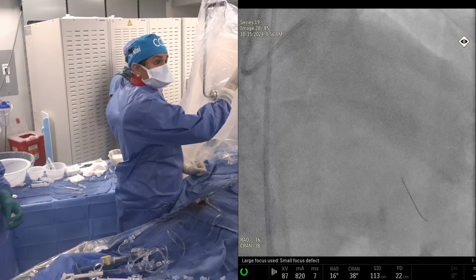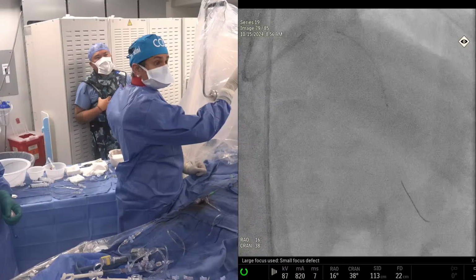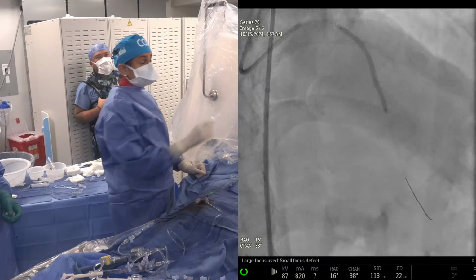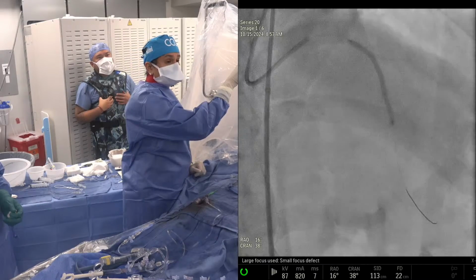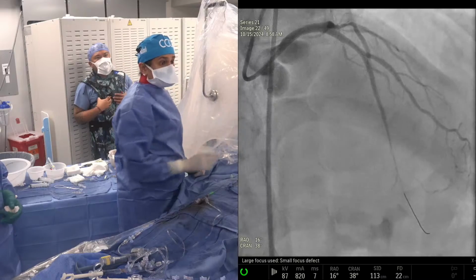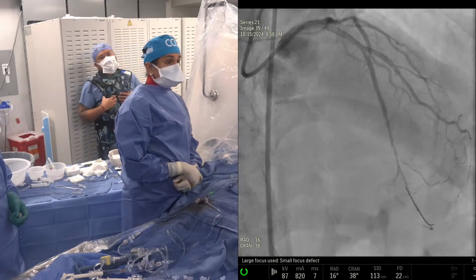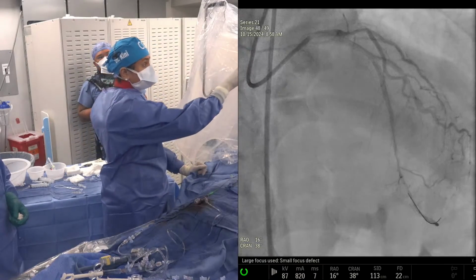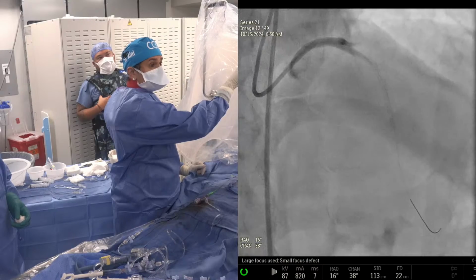Now we are able to get our, see, this is the 48 stent. Went easily. 2.75 by 48. That's how we placed it. This was again at 12 atmospheres because the distal vessel was just 2.5. So this is important: proximally we know the vessel was 3.5 and distally was 2.5. So we put a 2.75. You definitely need to dilate. So proximally you will post-dilate.